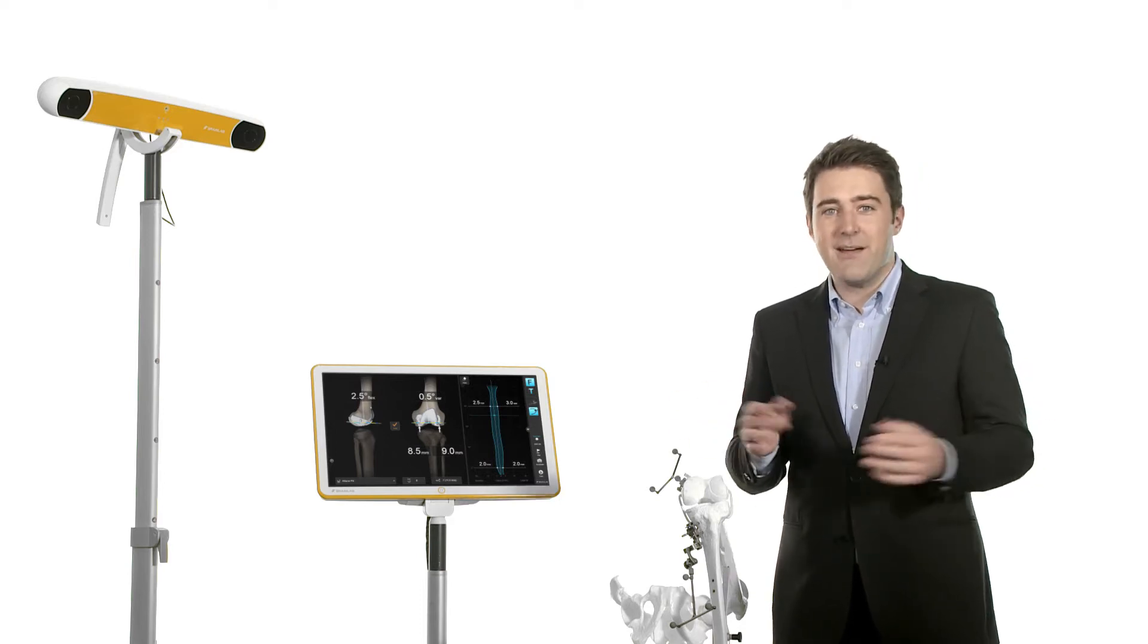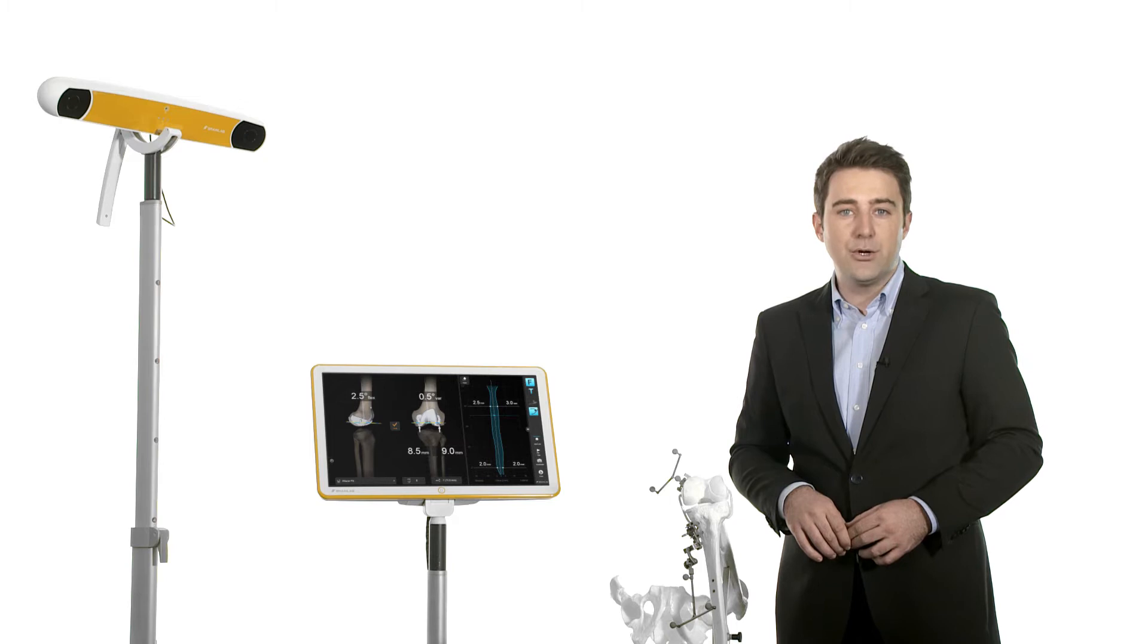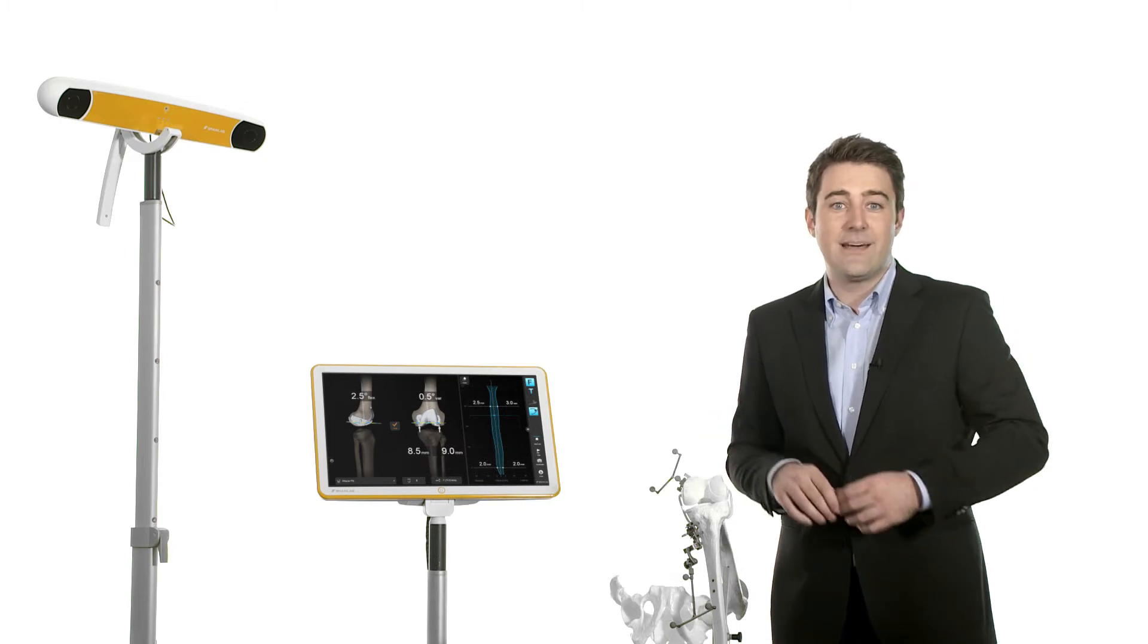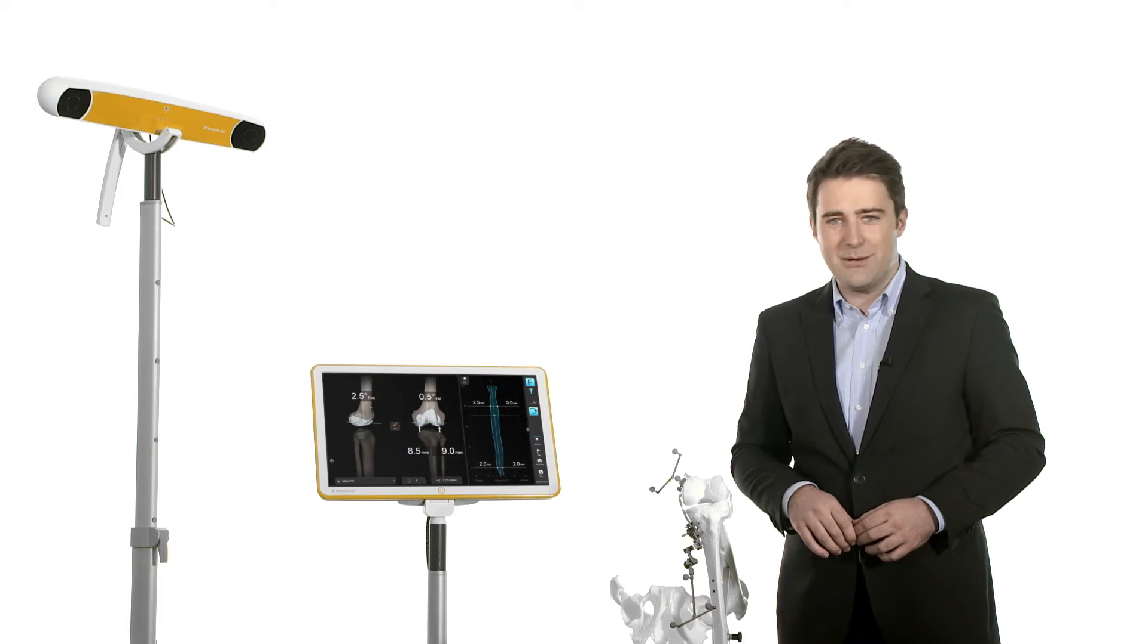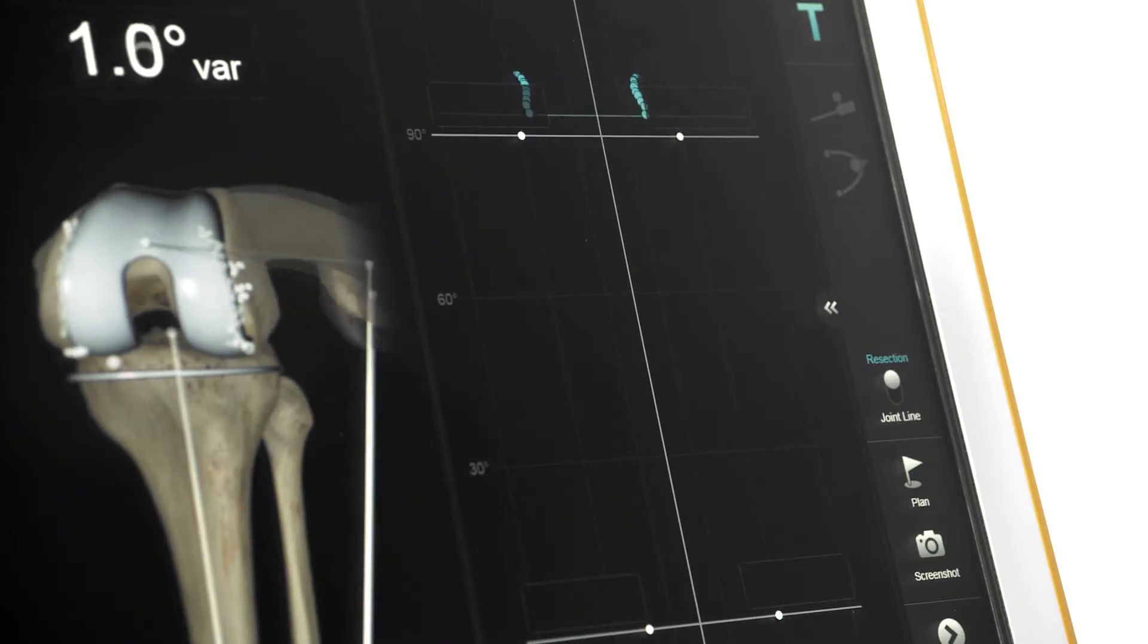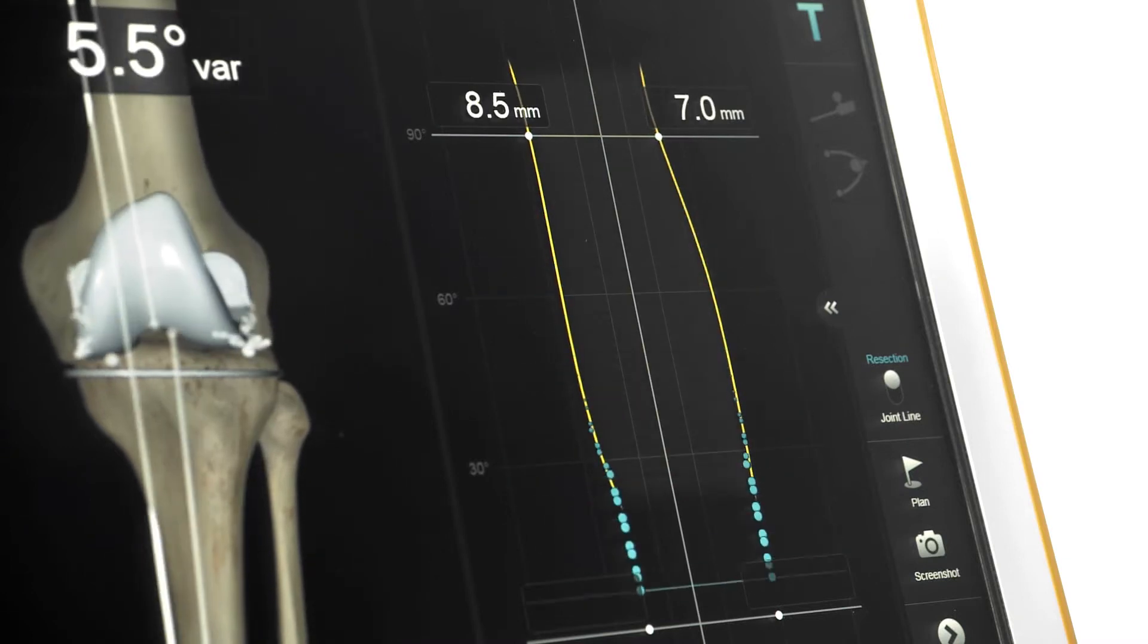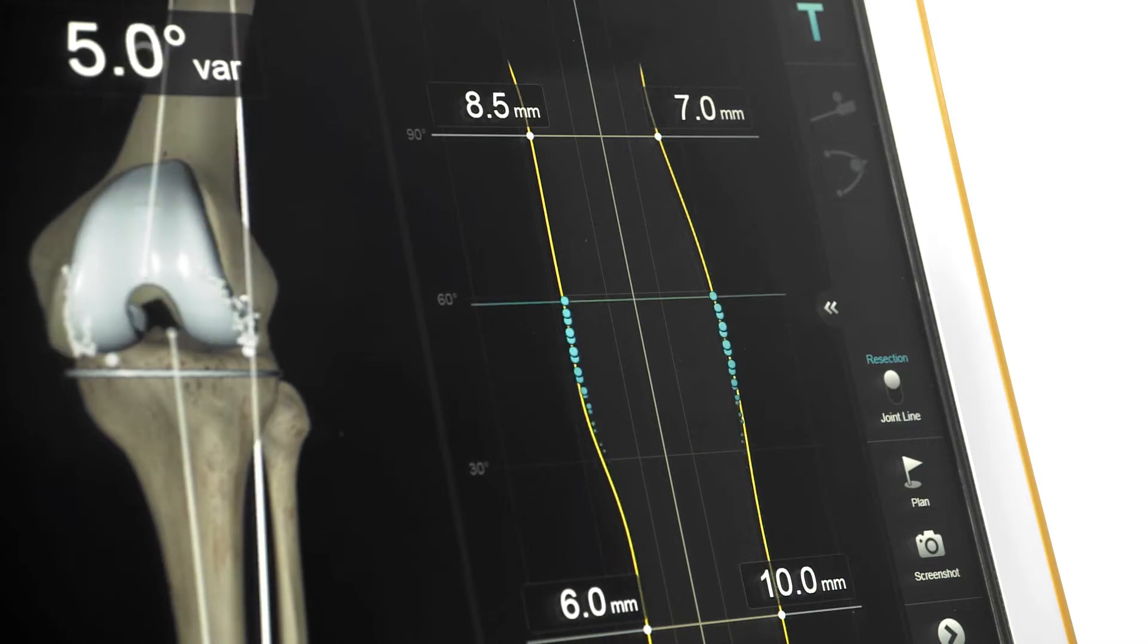For the first time, BrainLab presents a knee navigation software that visualizes joint stability over the full range of motion, allowing the surgeon to examine kinematic movement of the knee joint before any resection has been made. The key feature of Knee3, the balance graph, provides the surgeon with real-time feedback of the stability outcome and the potential effect of any surgical step.